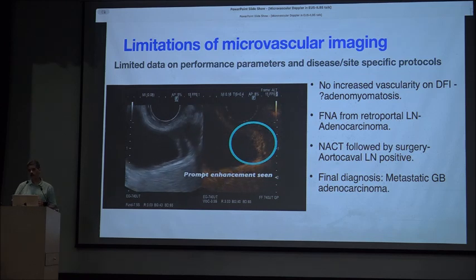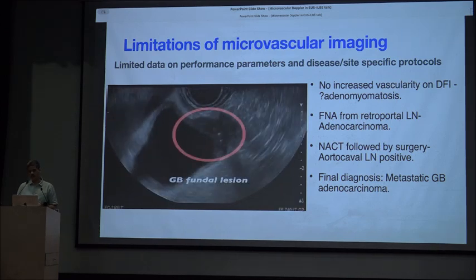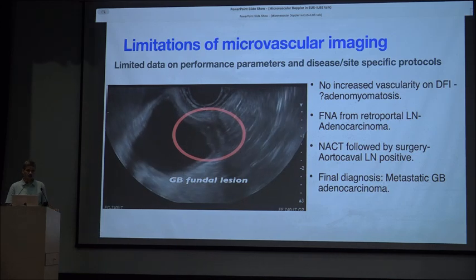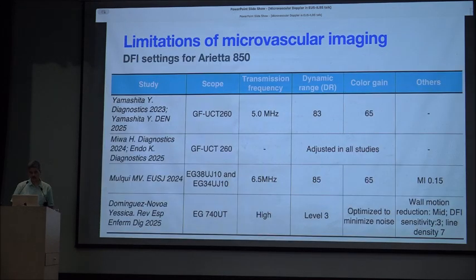So this is not adenomyomatosis, and just to show you that DFI is a relatively new technology, we have to be very cautious and still do multimodal imaging. We then went and hit a lymph node, which I would otherwise not have, and it turned out to be adenocarcinoma, and surgery proven subsequently.